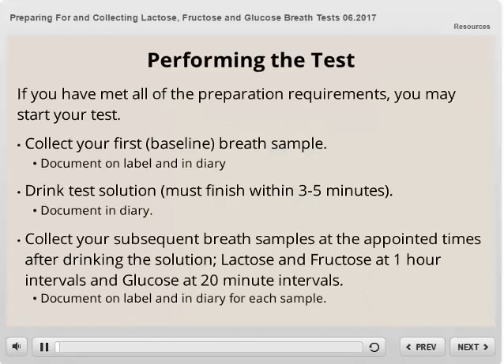When you have met all of the preparation requirements, you can start the test. The very first thing you will do is collect a baseline breath sample, as demonstrated earlier. Document the date, time, and tube number on a label and place on the tube. Document the time the breath sample was collected in the patient diary as well. Next, you will drink the test sugar solution — you must drink all of the solution within three to five minutes. Document the time you drank the solution in the patient diary.